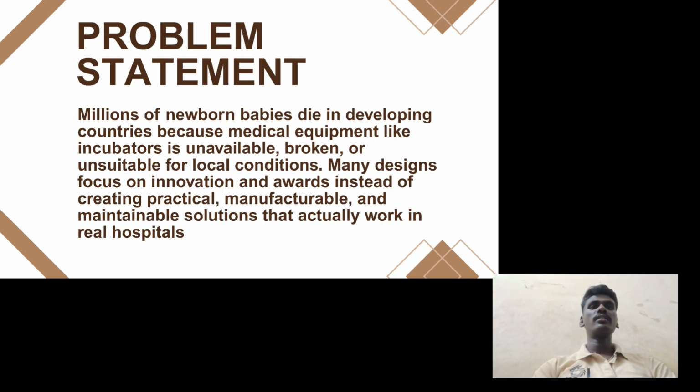In many developing countries, newborn babies die because hospitals do not have proper incubators. Incubators are very important for premature babies because they provide the right temperature and safe environment. However, in many hospitals, these devices are too expensive, not available, or stopped due to power cuts and lack of maintenance. This makes it difficult for doctors to give proper care at the right time. We are developing this project for Ladakh conditions.